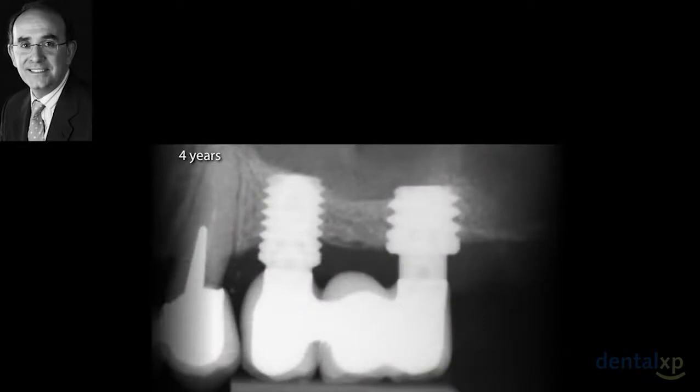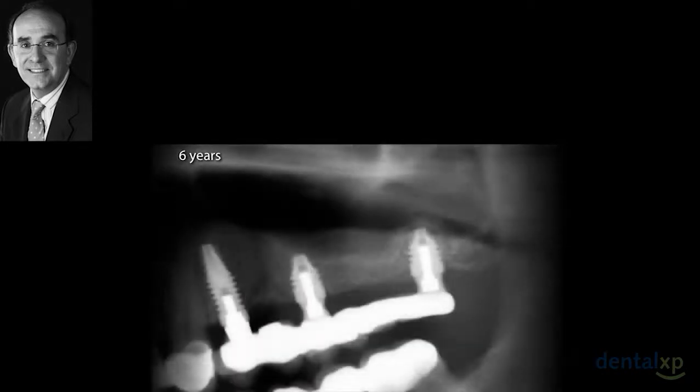In this situation, it is also possible to obtain apical growth and a very stable result after 4 years. Exactly the same in other cases. With 6 years follow-up, we can observe the perfect stability around the implants.